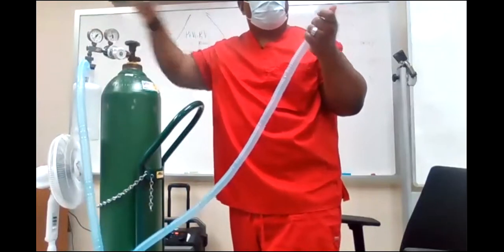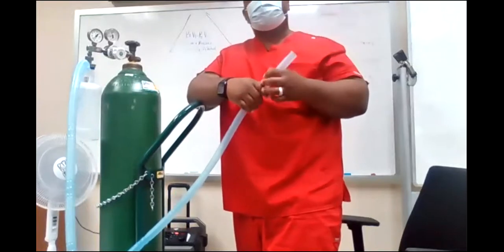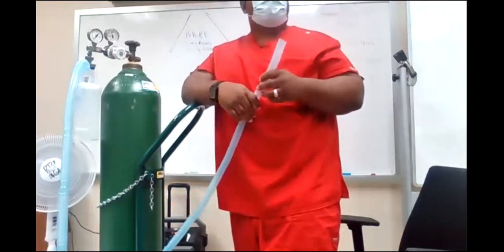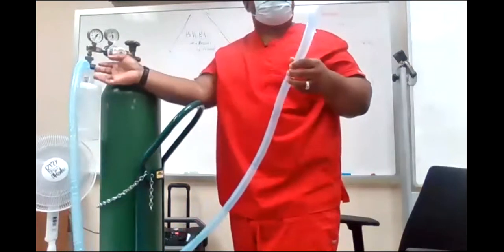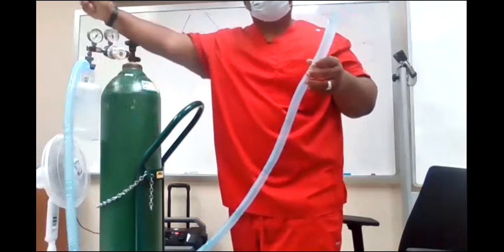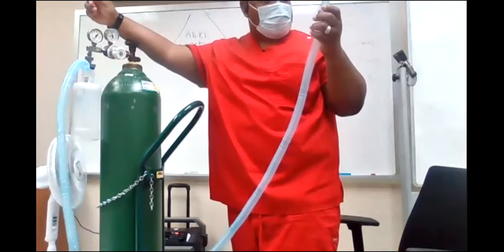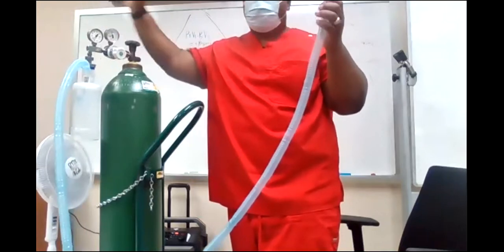As I turn the air on, the oxygen on here, the FiO2 is going to start dropping on my analyzer. If the doctor said I want him on 40%, and you don't have a Venturi setup, you can use the tandem one. You hook it up to oxygen, and then bleed your air in. As you turn the air up, the FiO2 is going to start dropping, and when it drops to where you want it, you leave it there.